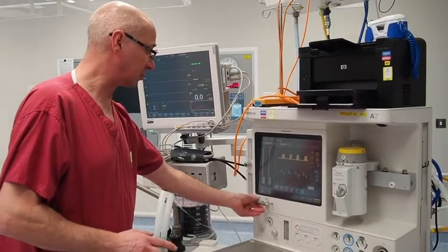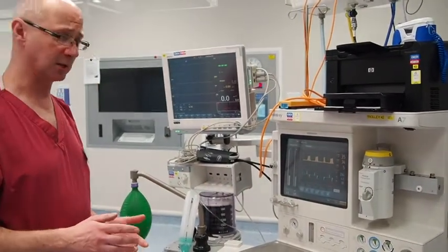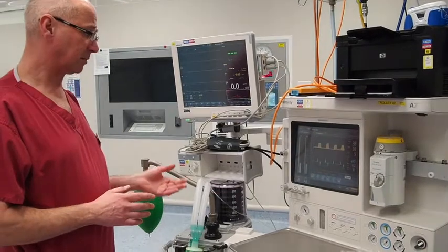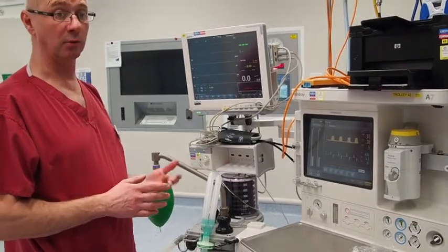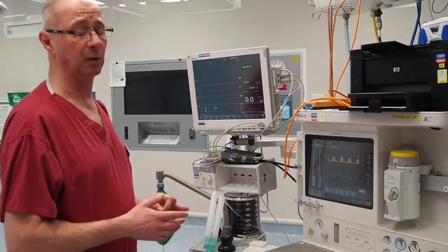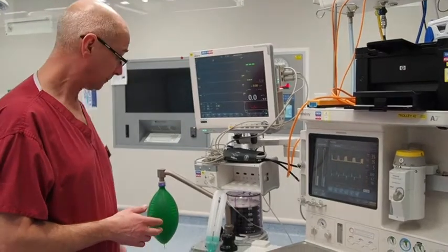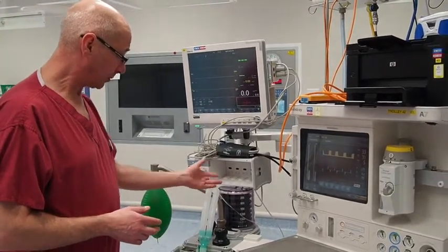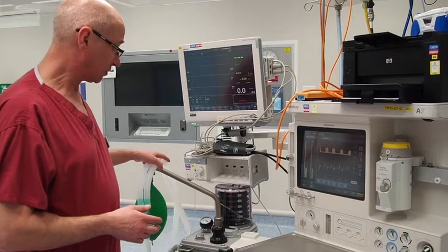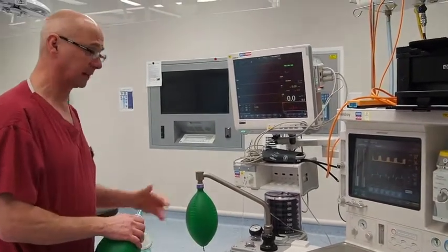Well, I think you need total flows of probably about 6 or 8 litres to start off for most patients. When you get more comfortable with the machine, you can go down in those flows, and that might be important if we start getting an issue with oxygen supplies. And you can go down to very low flows in this machine, down to about half or 1 litre quite happily. The only problem you'll get is that if there's a leak in the system, and this is different to ITU ventilators, the bellows will collapse.